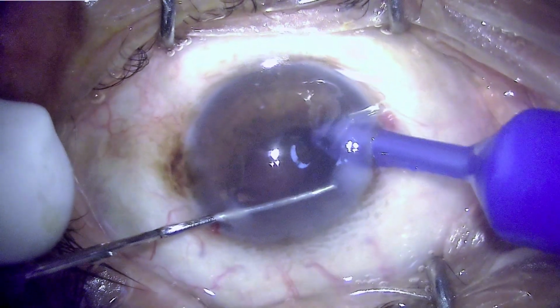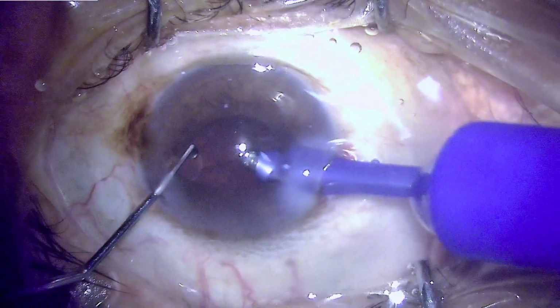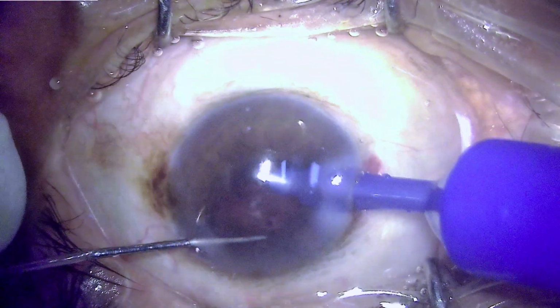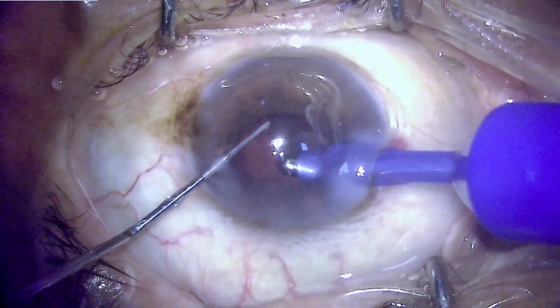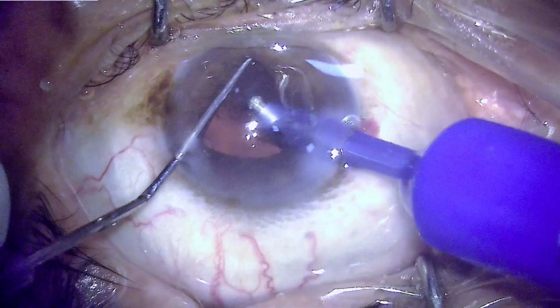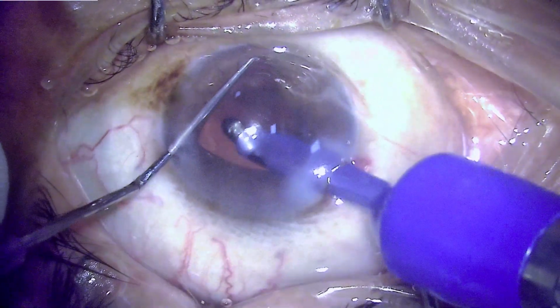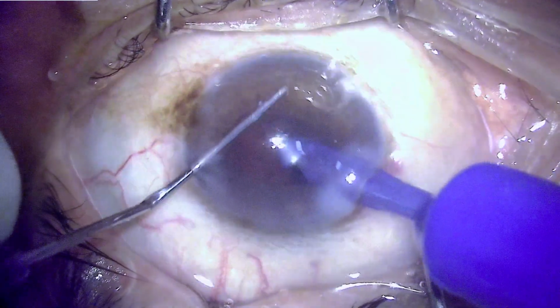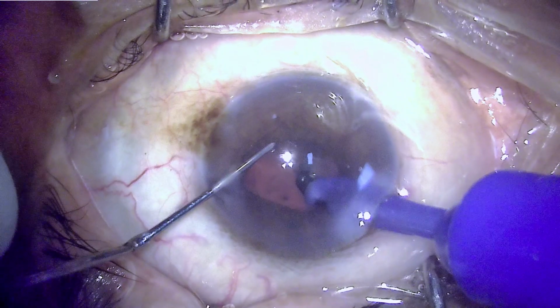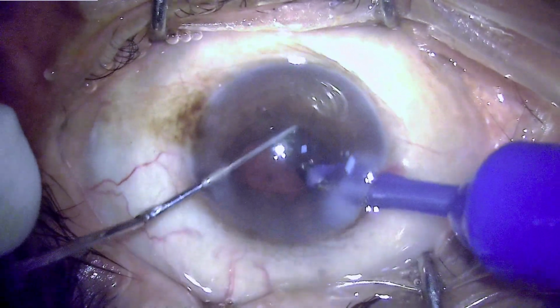The epinucleus is a little notorious because it is a thick plate which is difficult to mold, so one has to really remove the peripheral part of the epinucleus, then only is it possible to remove the whole of it. Here we have some amount of cortex left behind, which again is being visualized by lifting the iris up, and in this process one has to use the second instrument very effectively and safely.